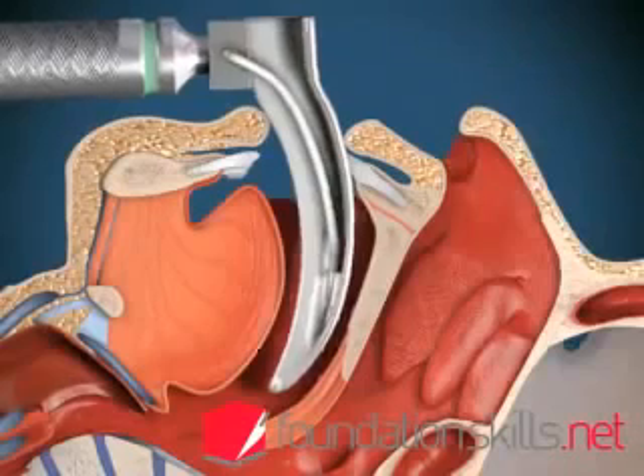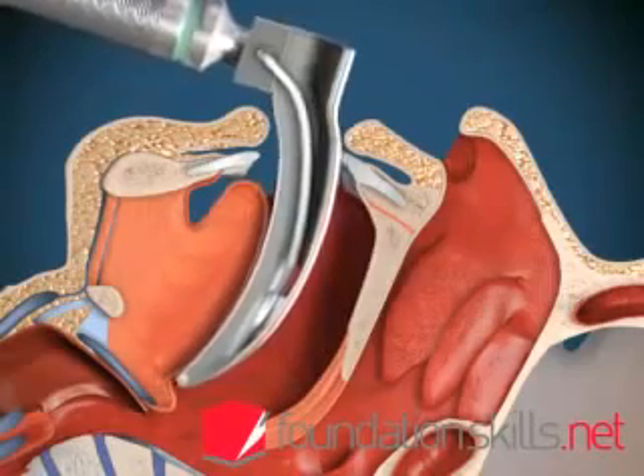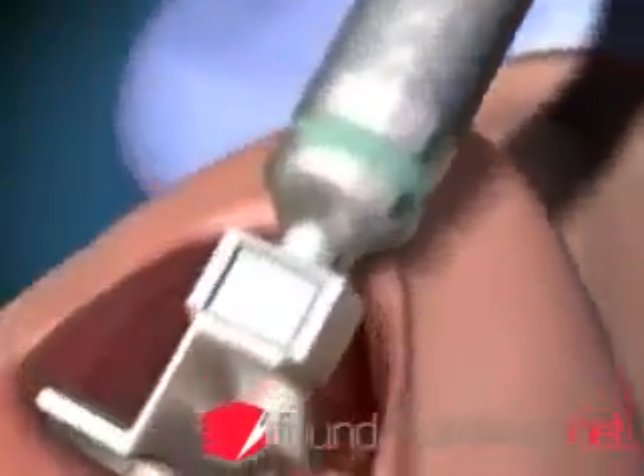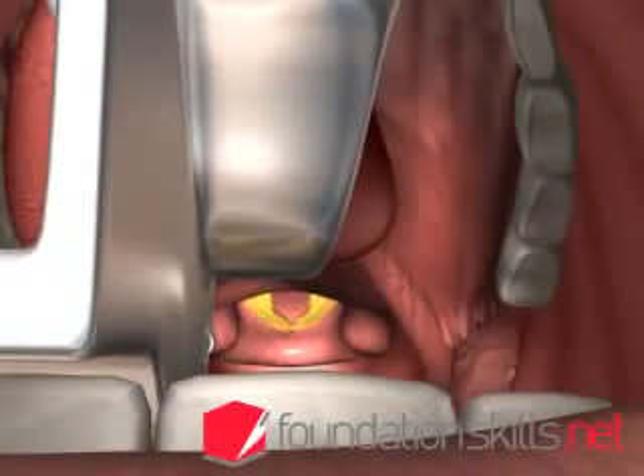Advance the tip of the laryngoscope blade into the vallecula between the epiglottis and the tongue. With the handle of the laryngoscope pointing away from you at 45 degrees, lift upwards and away to lift up the tongue and epiglottis to display the vocal cords and the laryngeal opening.